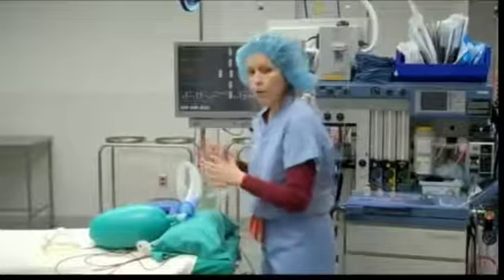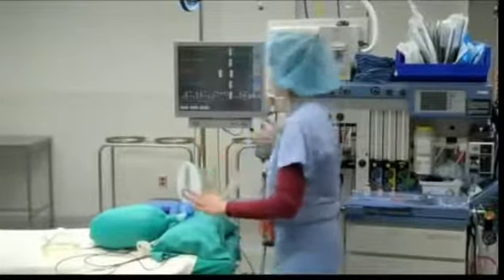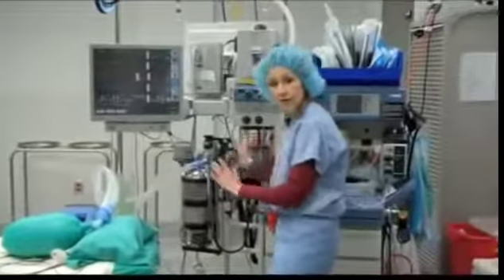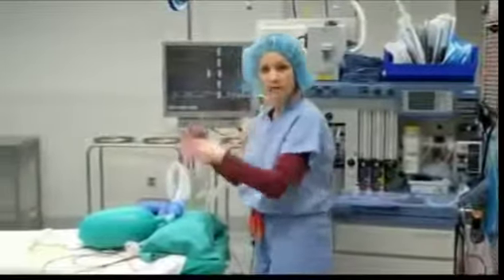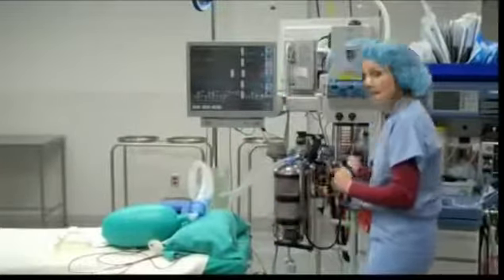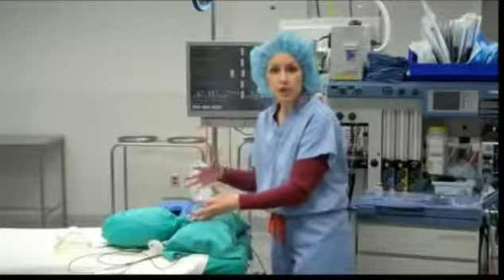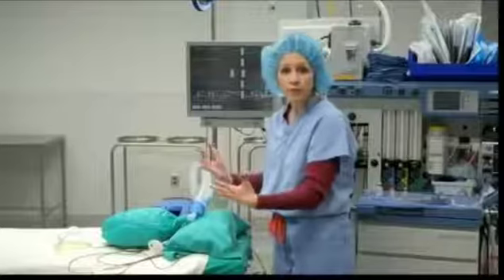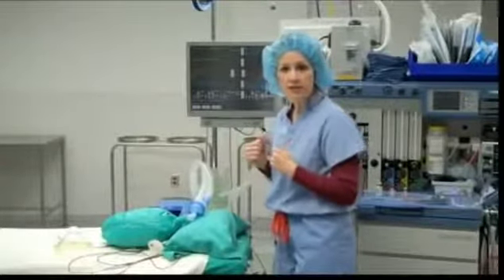Okay? Once we feel that he is just about to be completed, we then go ahead and we shut off the gas completely. We increase the amount of oxygen that is being delivered to the patient because we want the gas off of the lungs. We want it to get out of the body, okay? And we then take them off the ventilator because we want them to start breathing on their own, and we want to be able to assess exactly how strong they're breathing, how much air they're taking in, or how much oxygen they're taking in, okay?